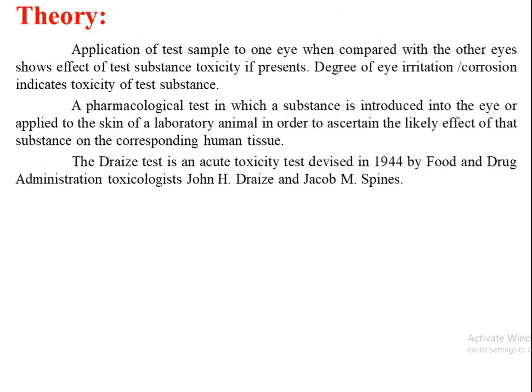In this experiment, one eye we will treat as the one to administer the test sample. Let's suppose if we consider the left eye for administering the test sample, then we will compare this left eye to the right eye, and the right eye we will treat as the control group.